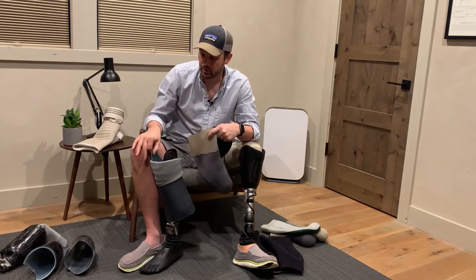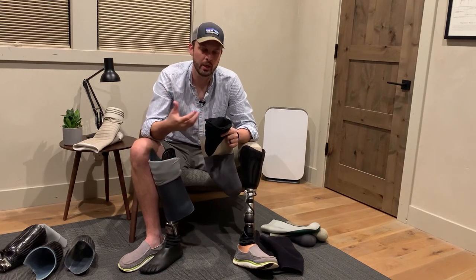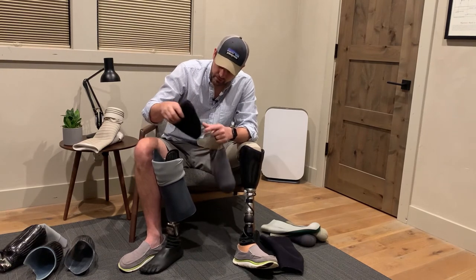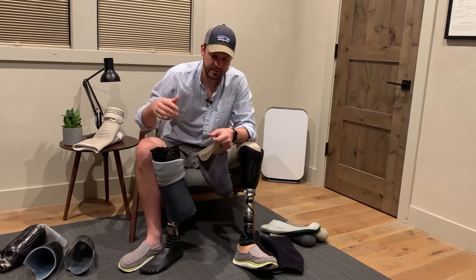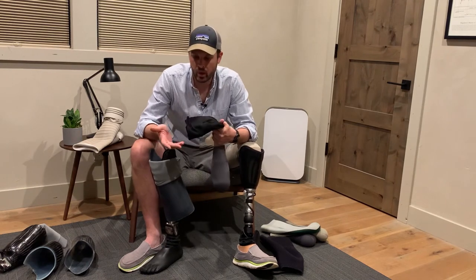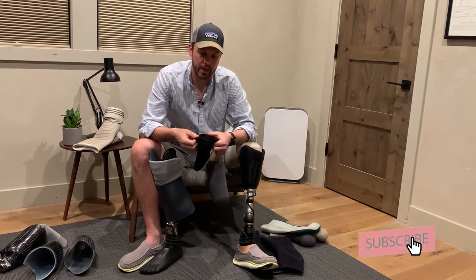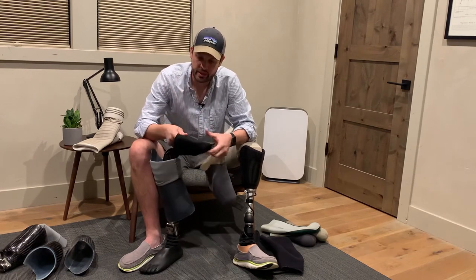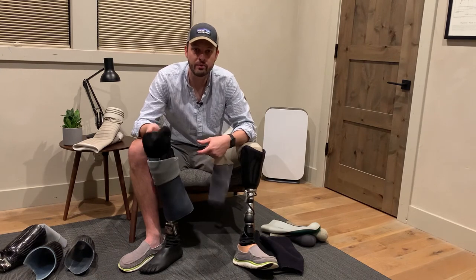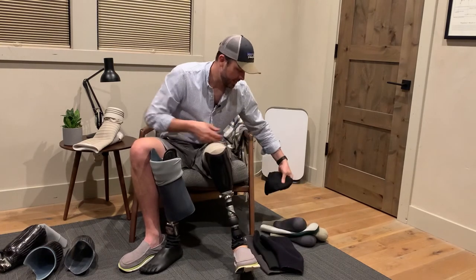Anytime I'm using one of my old sockets I have to wear a lot of socks because my leg has gotten smaller through muscle atrophying. The socks help fill in that space as your leg changes size — ranging from 1 to 20 ply depending on your preferences. The socks make it softer, but soft means less direct connection, so that's kind of a downside.